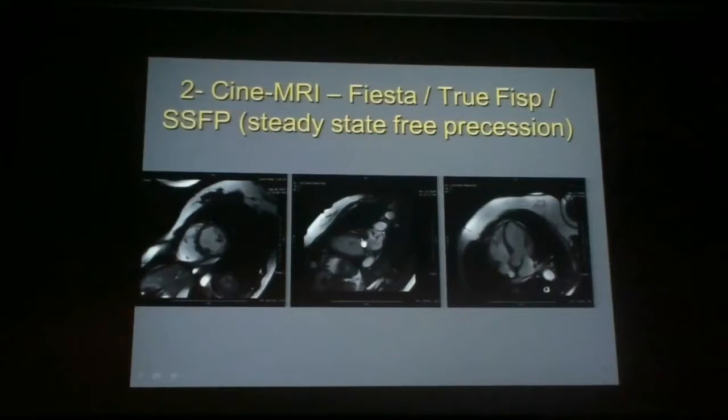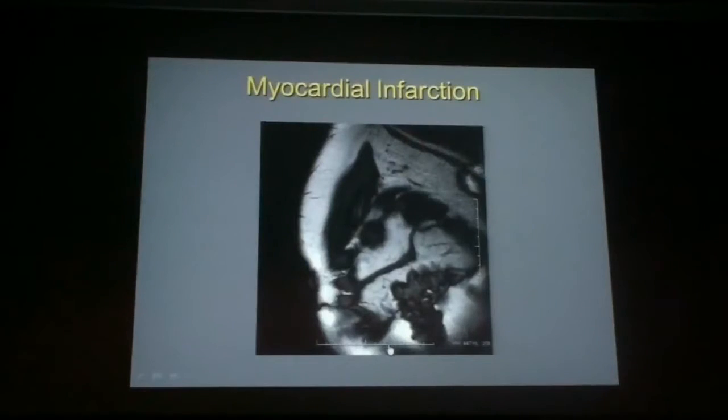If you see an anomaly, however, in the anterior wall, then you will lower these 60% and visually assess your ejection fraction to something that would be like 45–50%. And it's very useful because it will also help you be sure that what you measured with the software is close to what you're seeing with your eyes, which is sometimes maybe different.